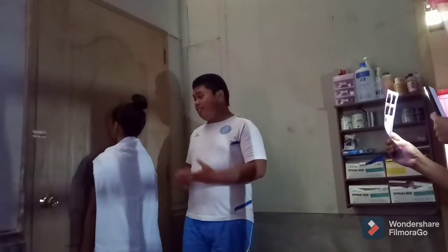Since today we are going to position the patient in an erect position, the arms are around the cassette. Instruct the patient that her arms would be around the cassette, unless a chest IR device is used, then position as for the ambulatory patient.